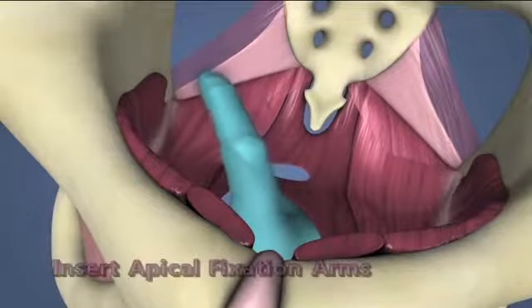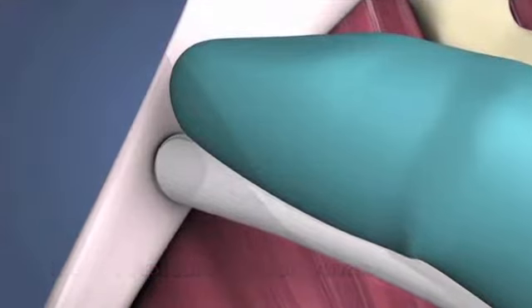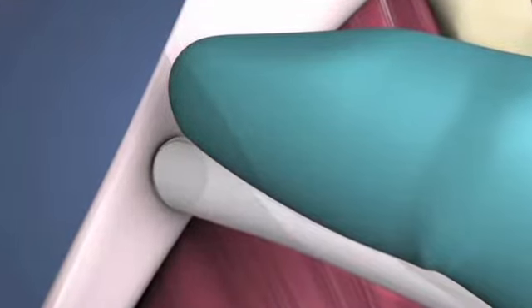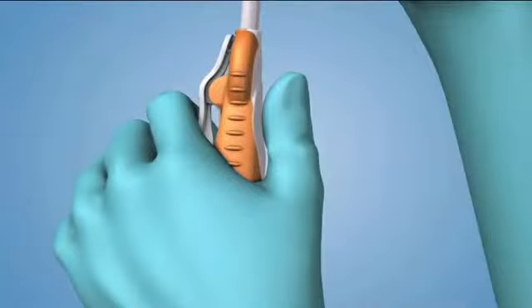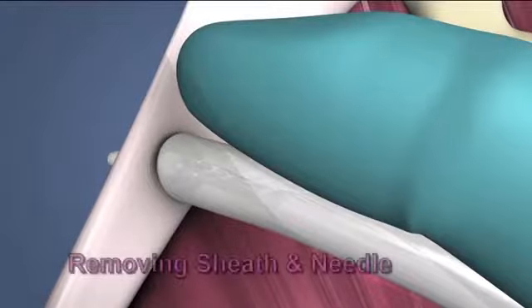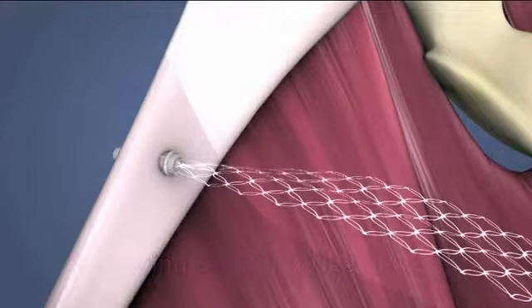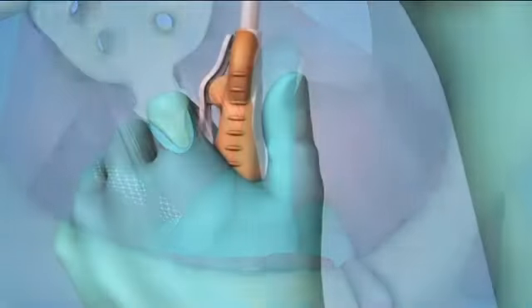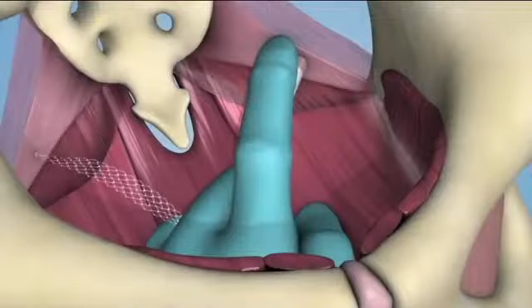Inserting the apical fixation arms. Place tip of the sheath at the base of the palpating finger, such that it is perpendicular and on the caudal side of the sacrospinous ligament, 2 centimeters from the ischial spine. With your index finger, press and hold the release mechanism on the handle and drive the needle and fixation tip into the ligament. Remove the needle and sheath by pulling back gently on the needle until it disengages from the tip. Pull gently on the fixation arm to ensure it is securely fixed in the ligament. Repeat these steps for placement of the fixation arm in the contralateral side.